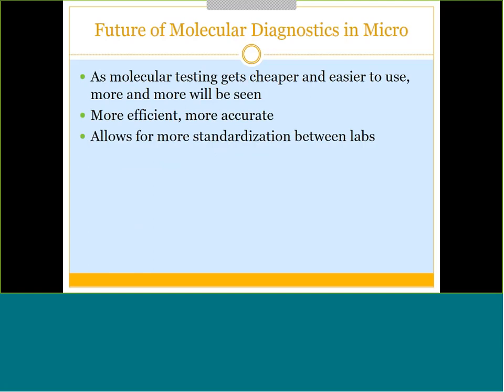I might run one of those little tests differently, or I might decide I want to do this test or that test. It was very subjective. With PCR, you throw all of it in there, it does it, and it spits it back out so fast. And it's a standardized process, instead of hoping that the tech is trained right, knows what steps to use, and doesn't go out of proper order.